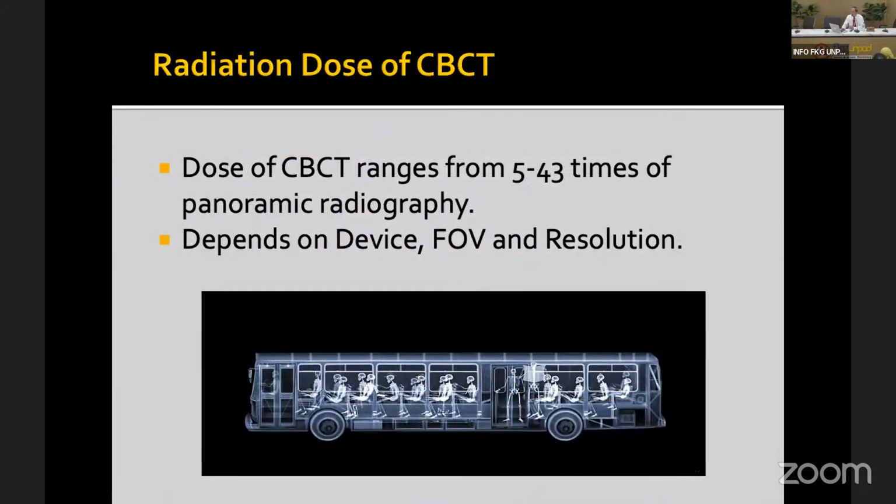Regarding the radiation dose of CBCT, often in the school people will ask, we know the intraoral and the pan doses, so approximately how many panoramic radiograph doses equal one CBCT? Certainly we cannot compare exactly.